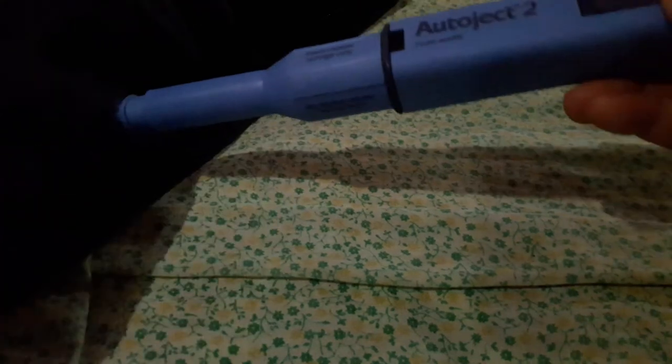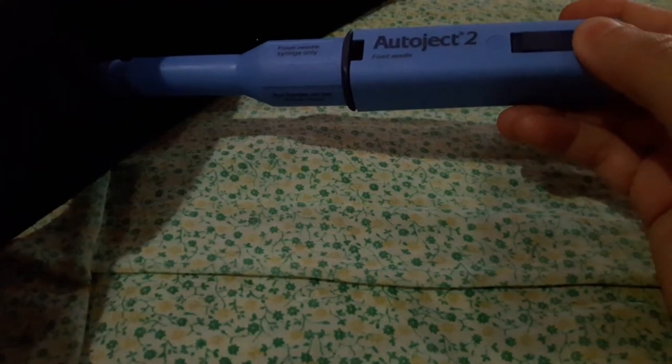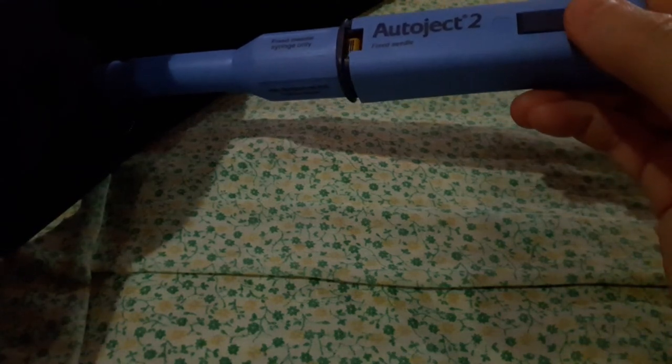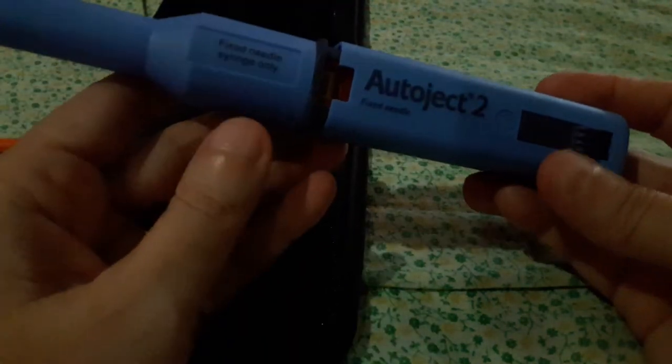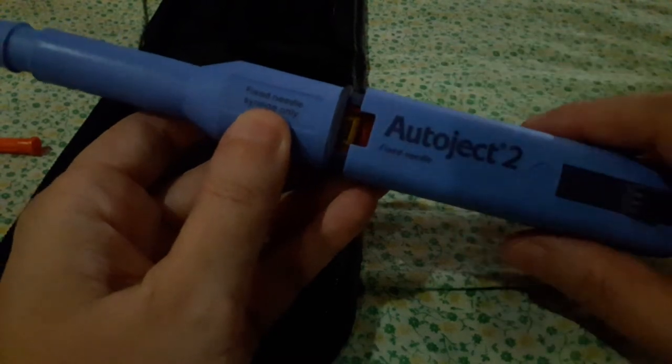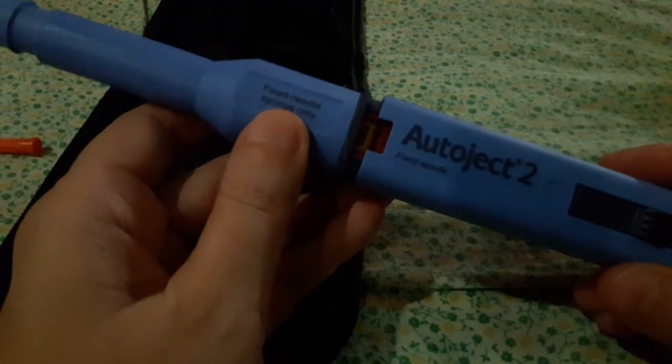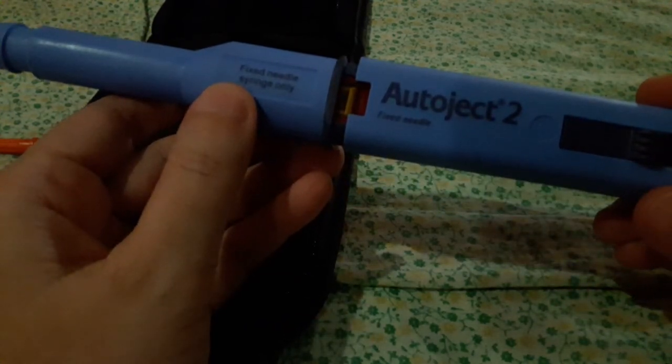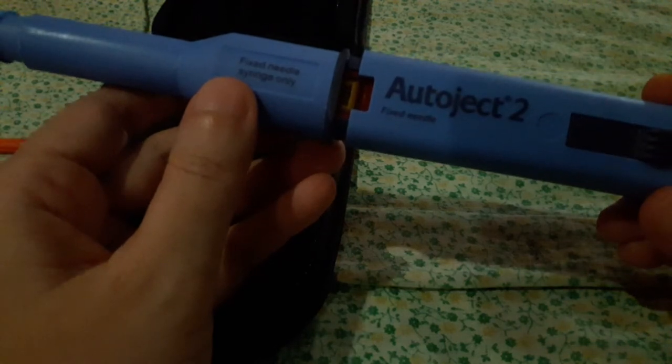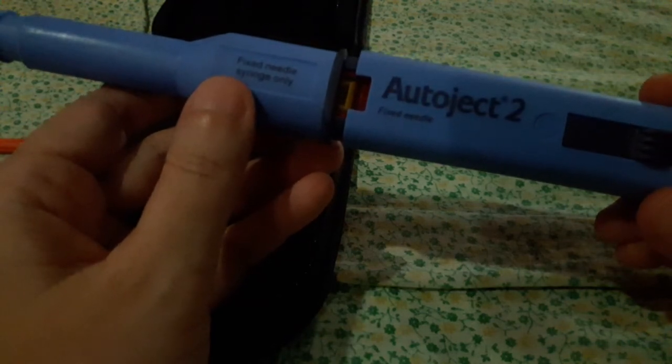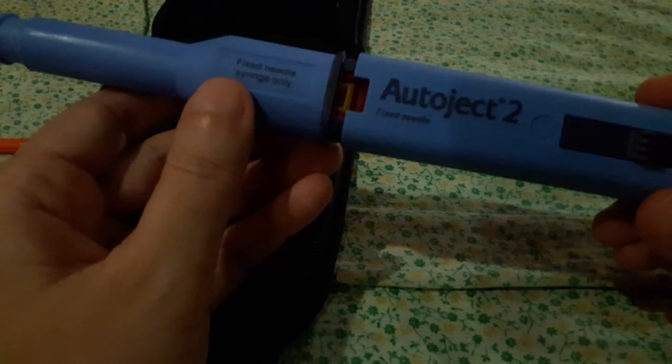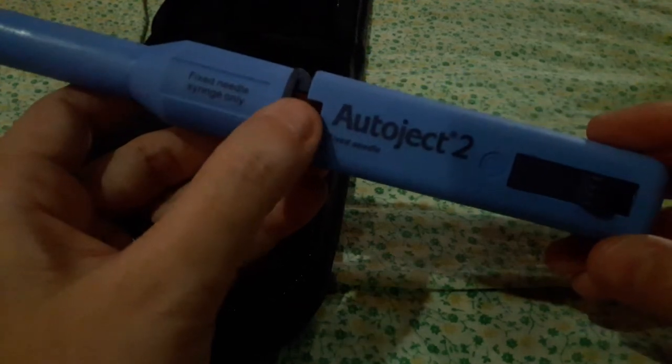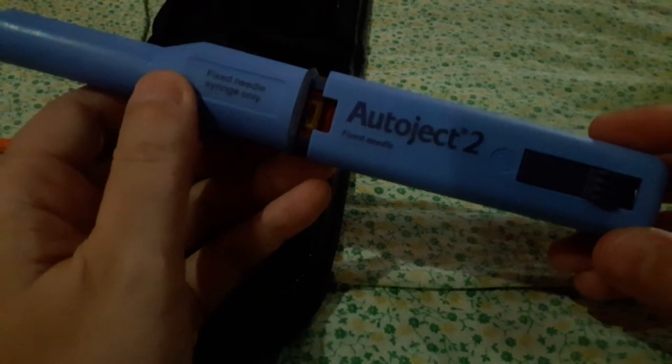So say you press it down, press, let's see, so then you're going to press this button. See that? And now it's yellow. And you'll see this window move down a lot slower. So don't let the sound startle you or your dog. I think the first time it startled me and then I pulled the needle out. And then I could just see the rest of the insulin spraying across the floor. So it takes time and just look at the window and let it all go down and don't get scared by the noise.